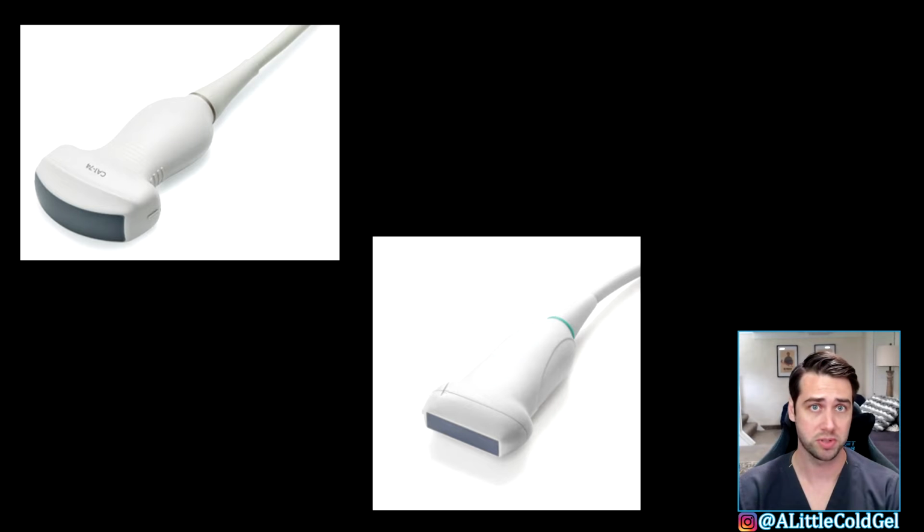First things first is probe selection, like always. The two probes that I use for bowel ultrasound are the curvilinear probe and the linear probe. Now, the curvilinear probe I usually use for diagnoses like small bowel obstruction and diverticulitis. It's a good way to survey the bowel and see if there's any gross abnormalities.